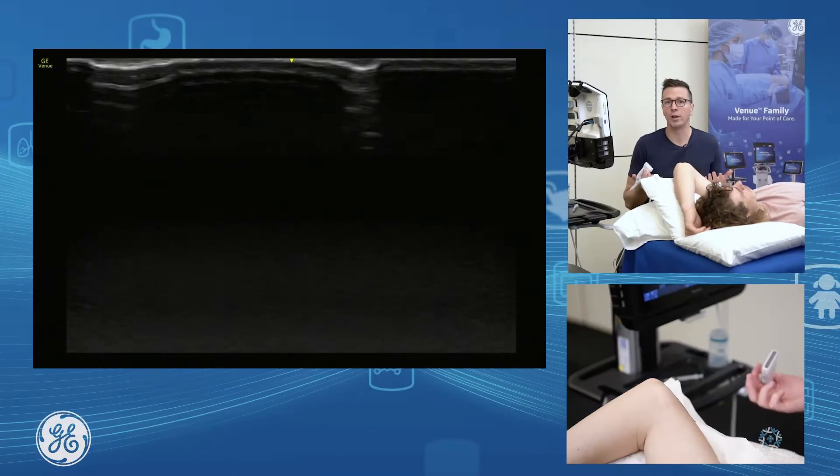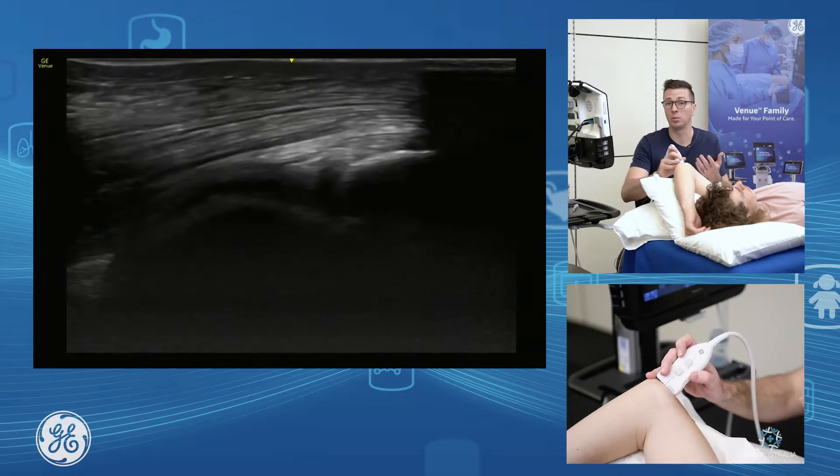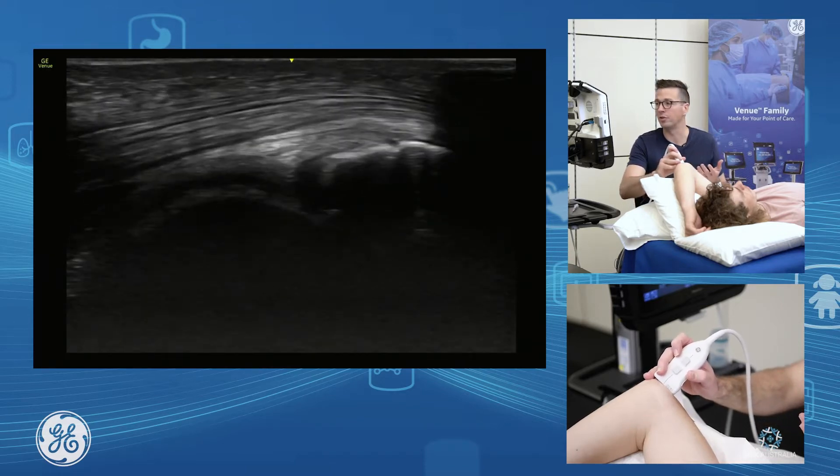Assessing our triceps, there are many ways to go about this. As long as you position your patient to get good access to the triceps, we're going to have a look at this one in through here. We're just going to put our probe longitudinal with our patient in this position.